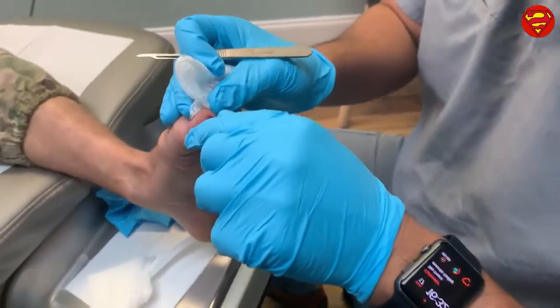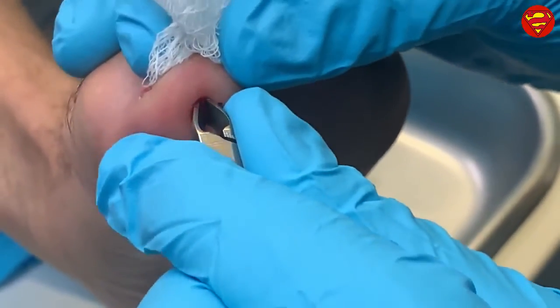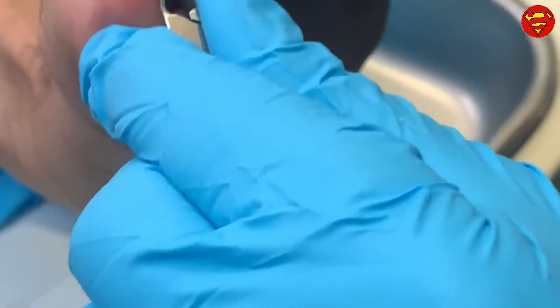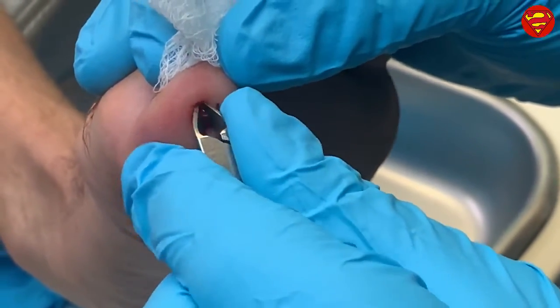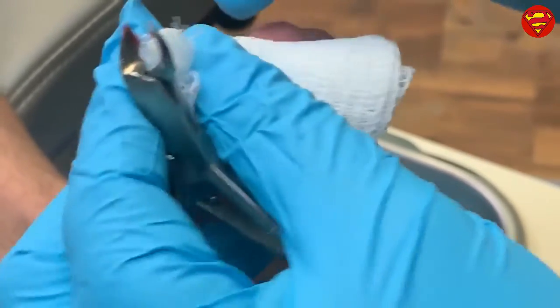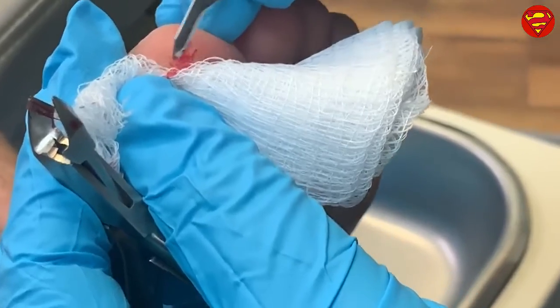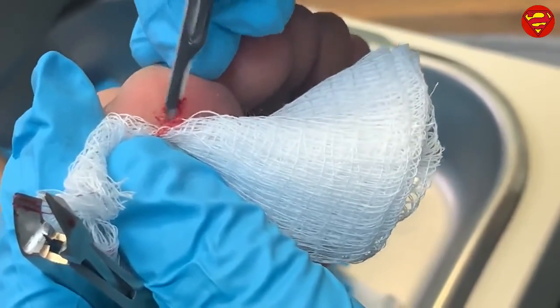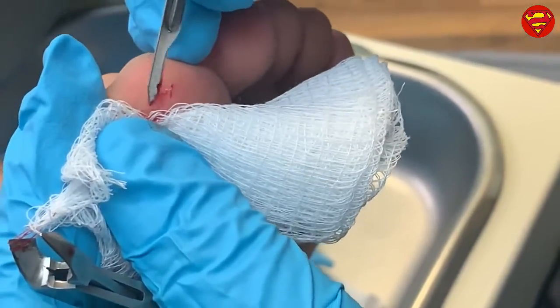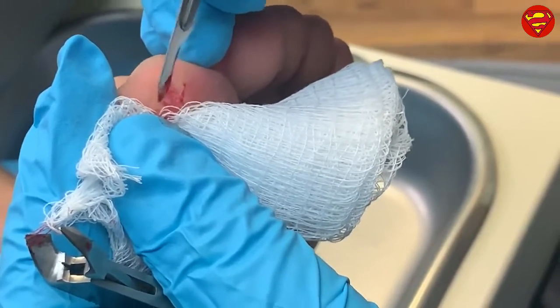So now we have our tools that we need. There we go. And I'm just making sure that we're at the right level. Again, not going past the basement membrane. And you're probably going to ask, how do you know, Dr. Cruz? How do you know? It's a white shiny layer. And you can usually hear it too. It sounds different, although I'm not really hearing anything different right now. Hold on. Yeah, you can kind of hear it.